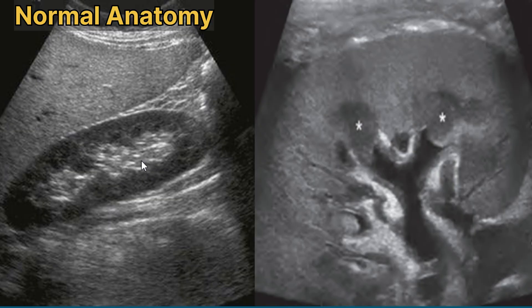The central renal sinus is composed of fibro-fatty tissues that appear echogenic on the sonogram. The cortical echogenicity of the kidney should be equal to or slightly less than that of the liver, and substantially less than that of the spleen.